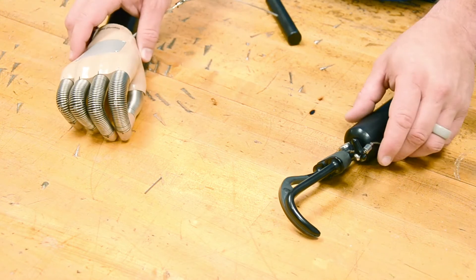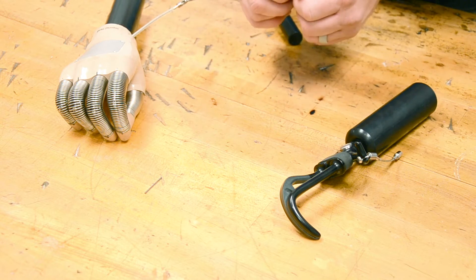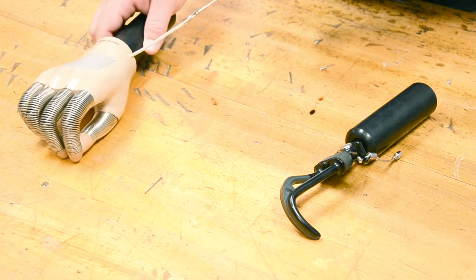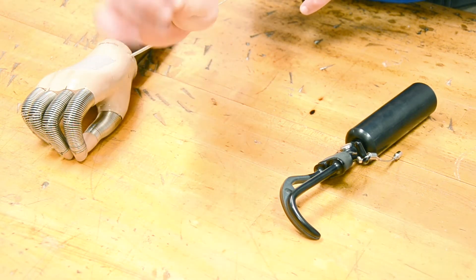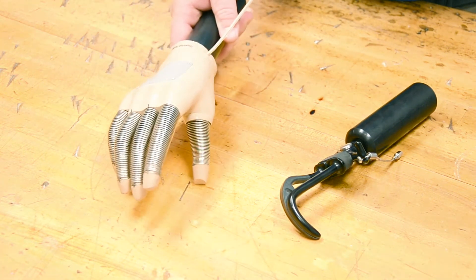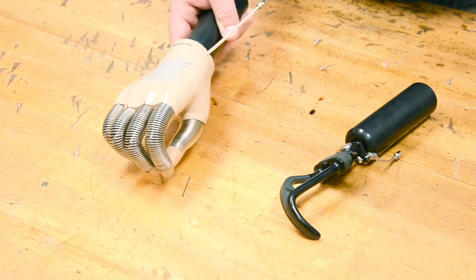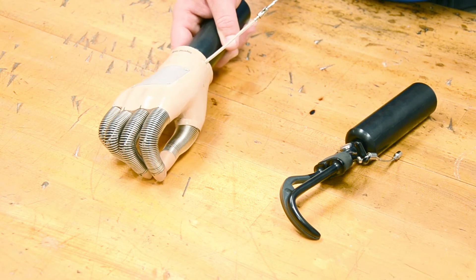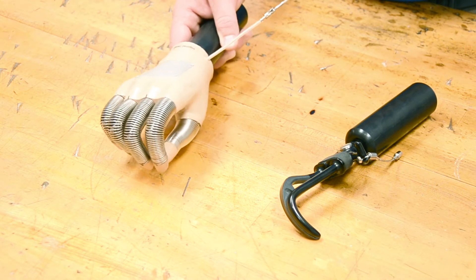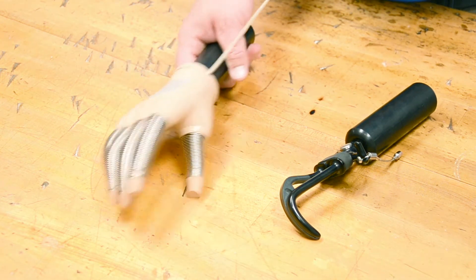When deciding between a hook, a hand, or any terminal device, it's really about understanding the functionality you're trying to gain. With a mechanical hand, if I'm trying to pick up something like this small piece of cabling, I have basically no fingertips to grab with — and most likely there's going to be a glove on it. It's a much less efficient, much heavier device than a hook, though it does give you some cosmetic appearance.